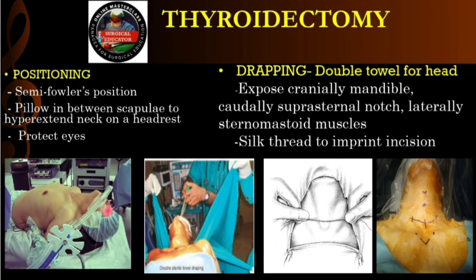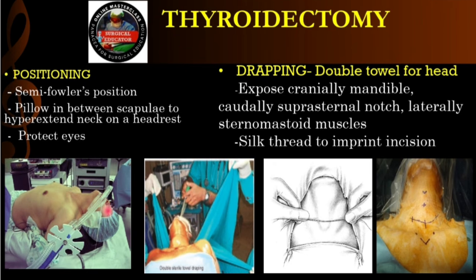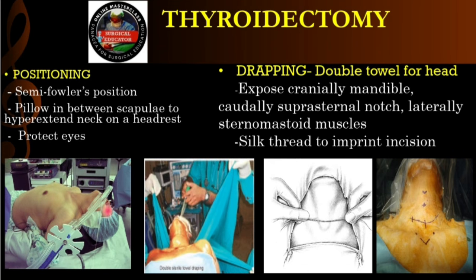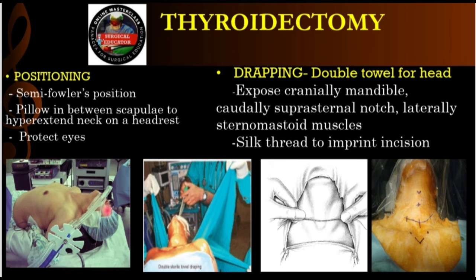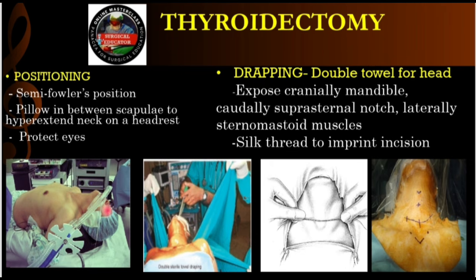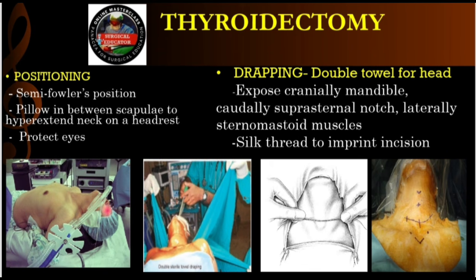But like, why? Why not just freehand a line with a surgical pen? Because human skin moves. Especially now because the neck is stretched into severe hyperextension. The skin is completely distorted from its normal resting position. Right. If you freehand what looks like a straight line on a stretched, curved cylinder, when they wake up and sit normally, that line is going to be wavy and crooked. It'll heal terribly. It might cut right across the natural skin folds. And look, the cosmetic outcome of a thyroidectomy is deeply important for the patient's psychology. It's right on their neck for the world to see. So the taut thread guarantees a perfectly symmetrical geometric line.